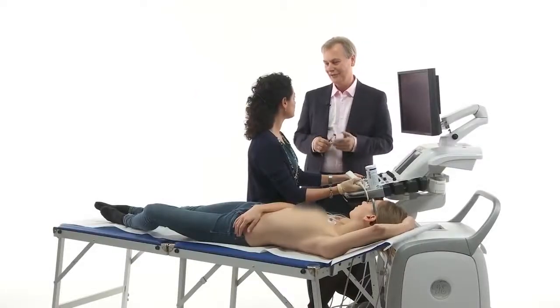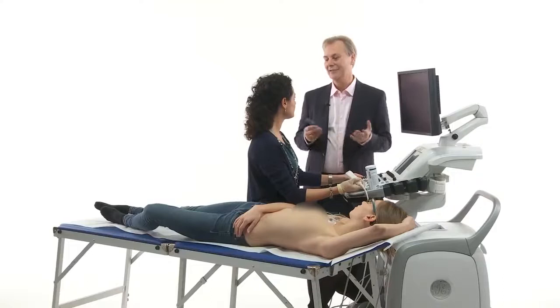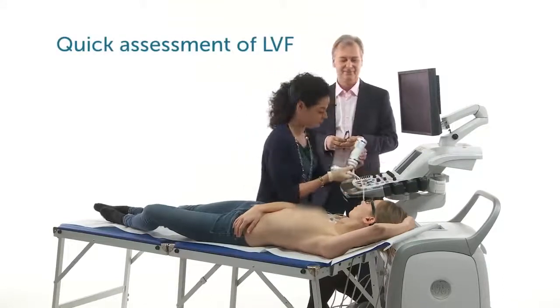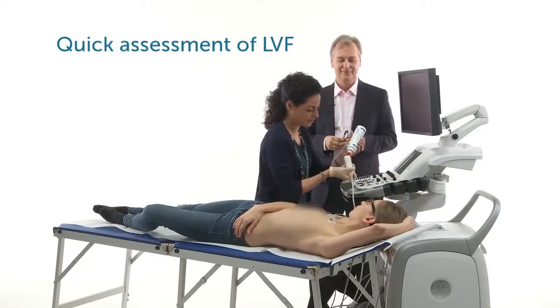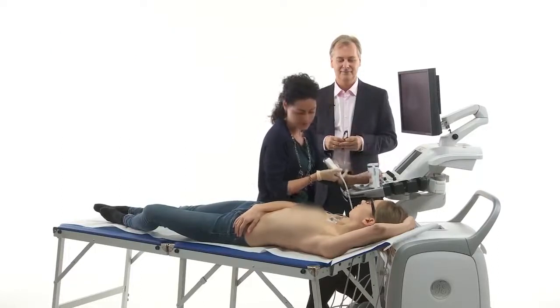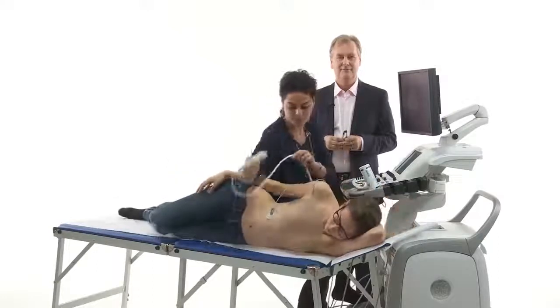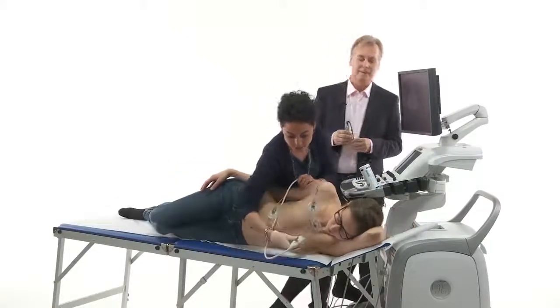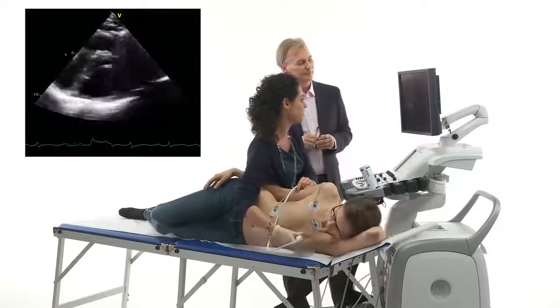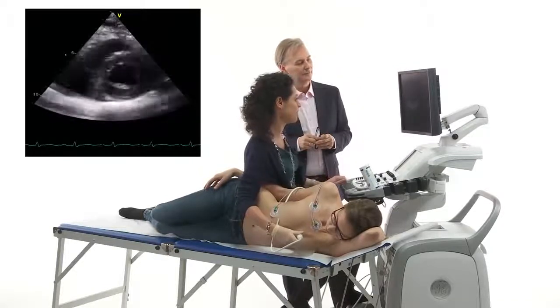Imagine you're rushed to a patient to find out how his left ventricular function is to save his life. How would you go about? I would be really quick and easy — put the gel on my transducer, ask my patient to turn on his left. Then I would place the transducer on the chest, left part, and I would have a direct image of the left ventricle.